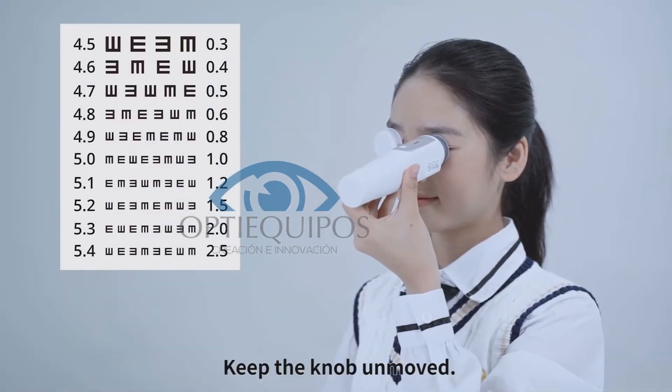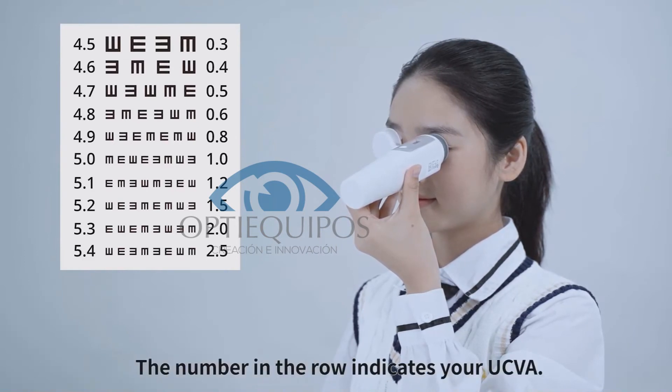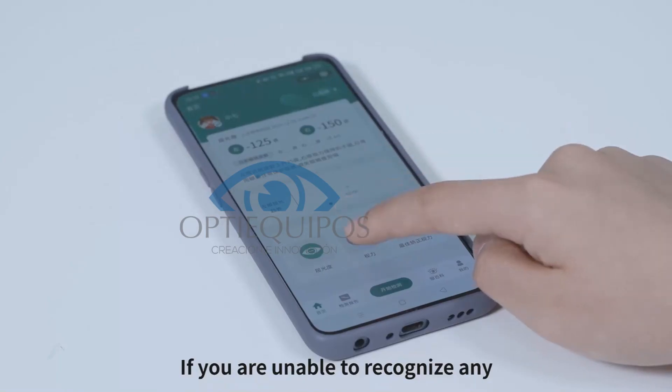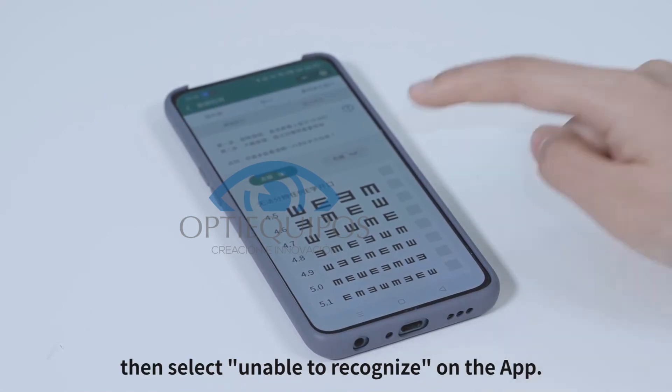Keep the knob unmoved and find the row containing the smallest E you can see. The number in that row indicates your UCVA. If you are unable to recognize any, select 'Unable to Recognize' on the app.